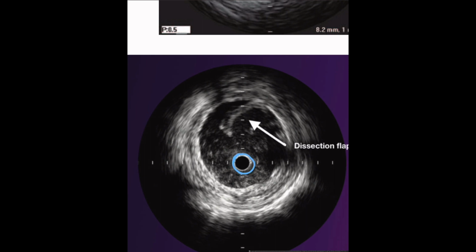So you have the catheter, you have definitely this darker lumen out here. You have your media actually out here. Okay, so your intima is here, because that's the wider part, the media, and then the adventitia. So in here, this was all the lumen. So you have this intimal flap that kind of separated from the wall and comes into your lumen space.